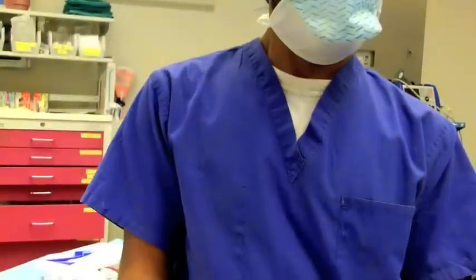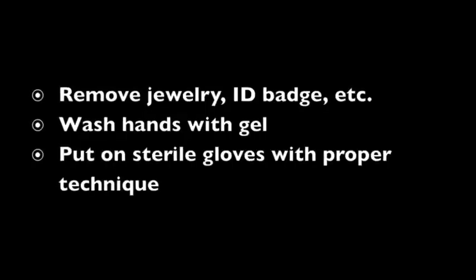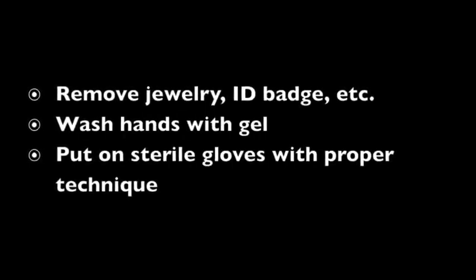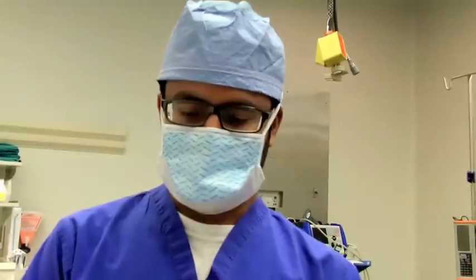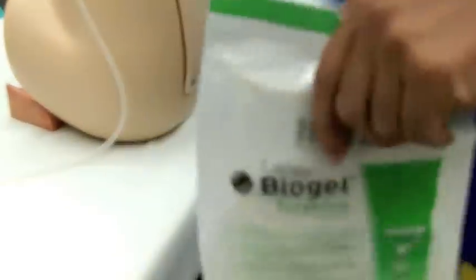Remove jewelry, ID badge, wash your hands. I'm going to remove my pager, my ID badge, my phone, take off the non-sterile gloves, prepare my sterile gloves.